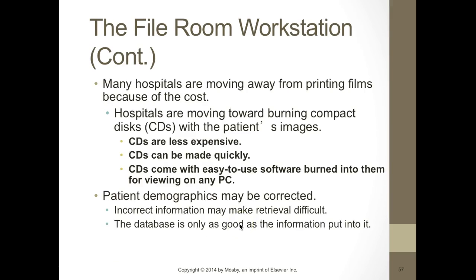Many hospitals are moving away from print films because of the cost. It's very expensive. They're moving towards burning CDs. CDs are less expensive, can be made within a couple minutes, and they're easy to use. Software is burned onto them so that they can view it from any PC. So it's DICOM images with a software package that allows patients or doctors to view it.